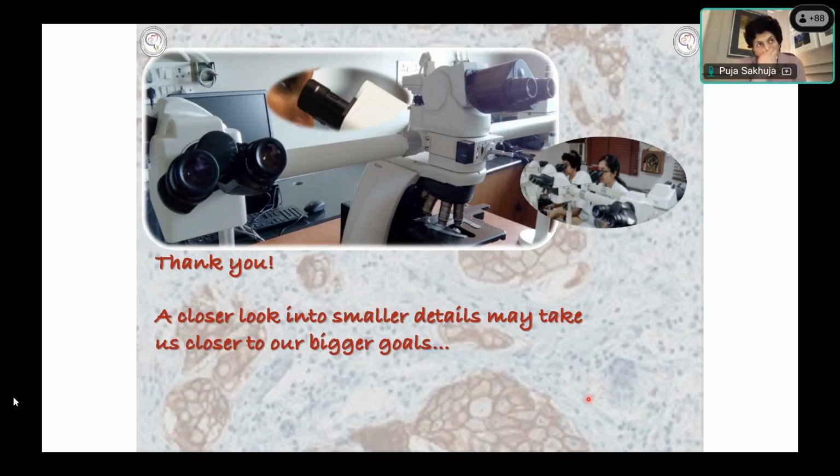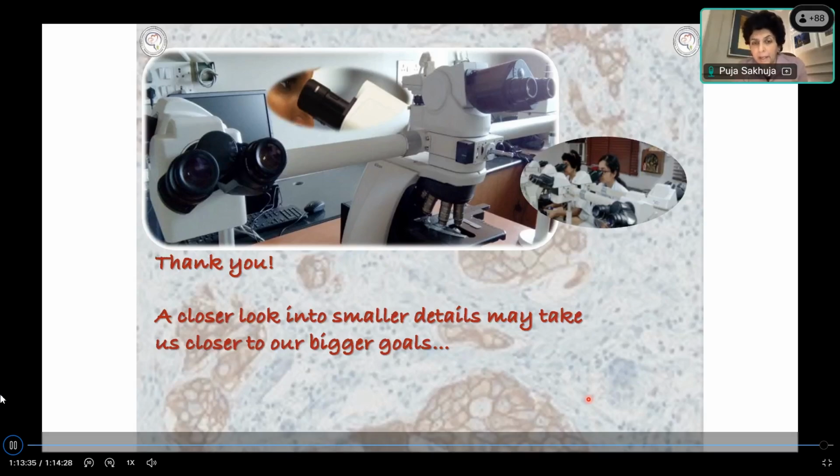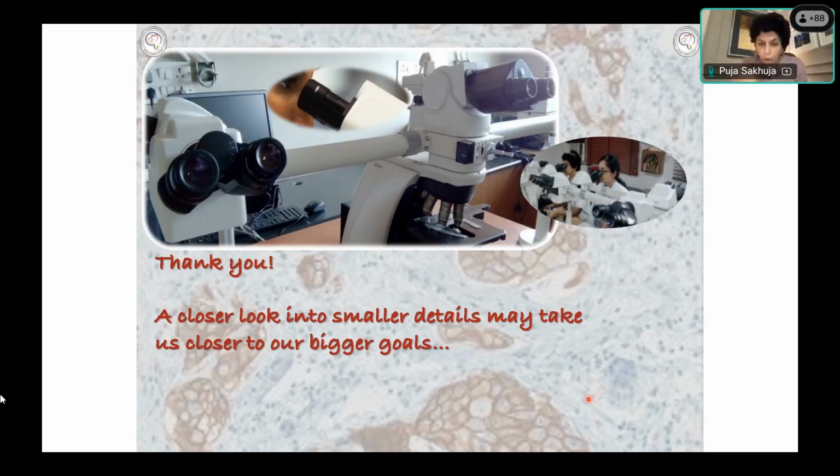In pseudomembranous colitis, usually you see much more exudate, and in ischemic colitis you will see an infarcted appearance of the epithelium. The shadows of the epithelium, of the epithelial cells and the morphology of the epithelium, may still be remaining. That you see more commonly in ischemic colitis, whereas in pseudomembranous colitis, the history is very important, which is why we cannot give any reports in isolation. You have to have the clinical details.